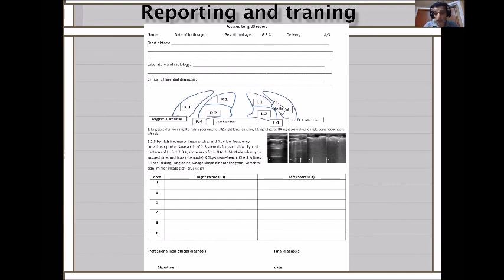Don't do the transverse, okay? Use the superficial for 1, 2, and 3. And for 4, use the deep structure, curvilinear. You can use it with asthma before and after bronchodilators, whether inhaler or nebulizer or steroid or whatever you're doing, using it for bronchiolitis, for pneumonia, for TTN, for RDS, for pneumothorax, for pleural effusion.